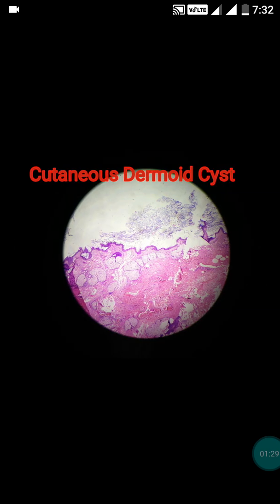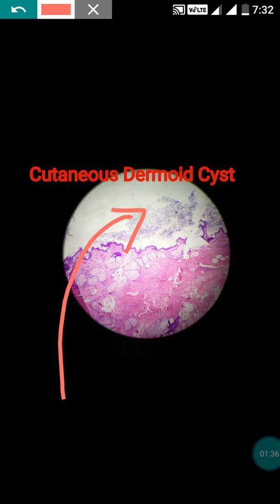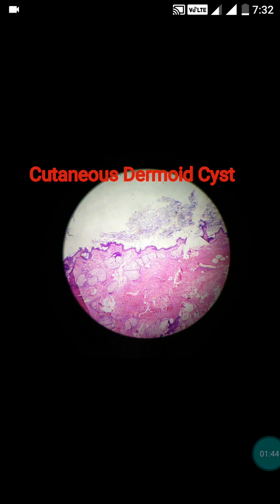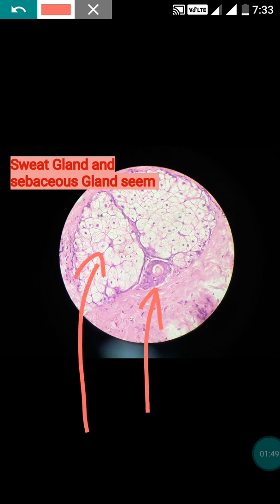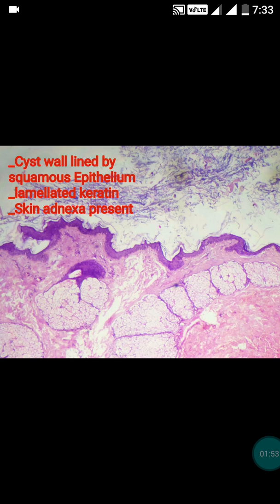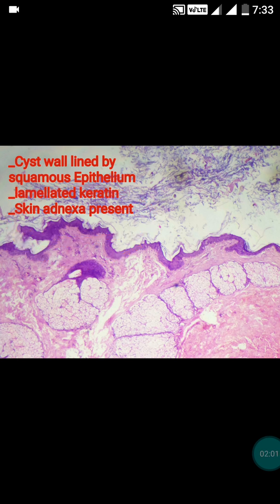For the diagnosis of cutaneous dermoid cyst, remember three points: there should be presence of lamelated keratin, there should be lining epithelium, and there should be presence of skin adnexa — particularly sweat glands and sebaceous glands. If the similar morphology is seen but skin adnexa is absent, then the diagnosis will be epidermoid cyst.